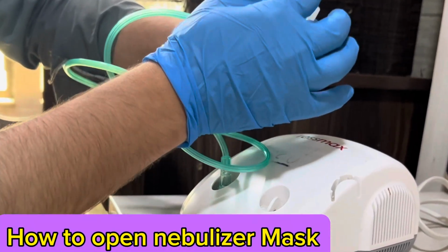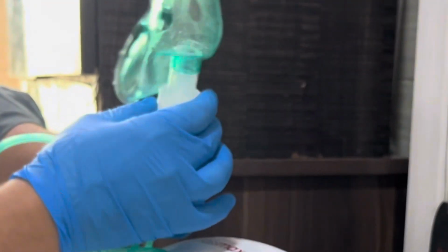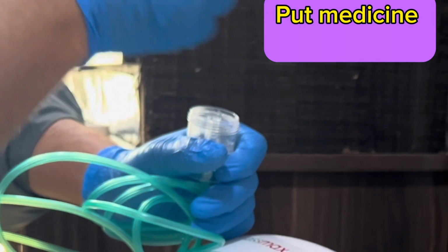How to open the nebulizer mask? You use a rotation motion. You should rotate it anti-clockwise. It will open. After that you put the medicine in the nebulizer tube. Put the medicine in it.